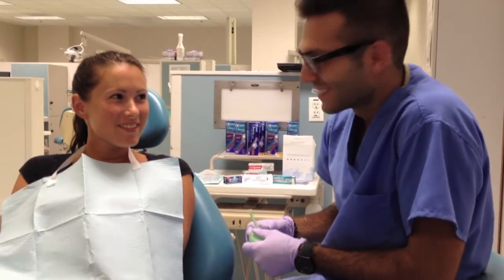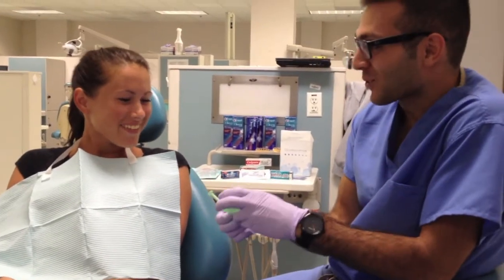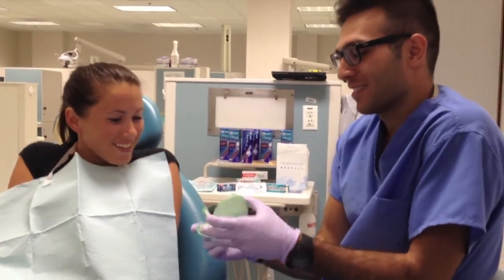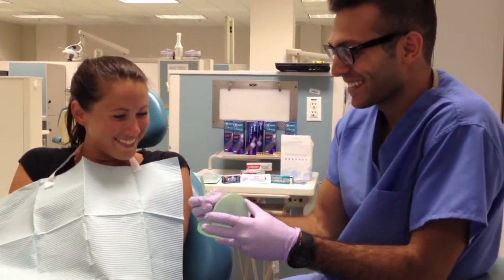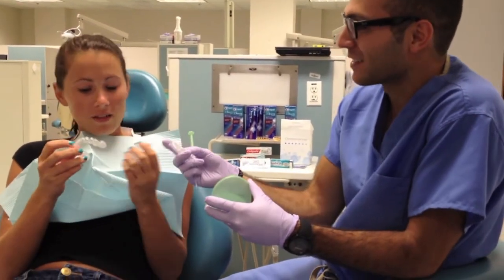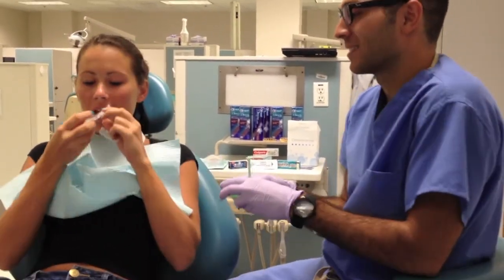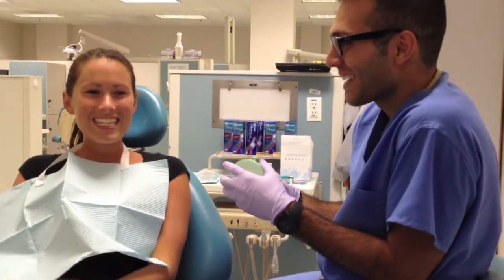Good luck. Welcome back. Thank you. What we have here are your whitening trays, custom made for your mouth. Yay! Yeah. Exciting. Here's your upper tray and this is for the lower. Go ahead and try them in. These are my teeth? Yeah. They fit. That's the plan!